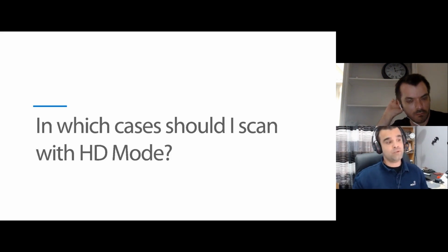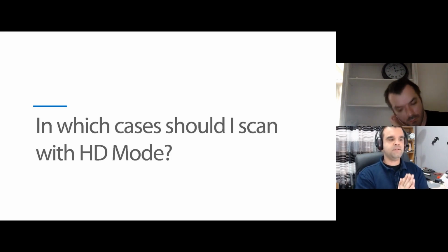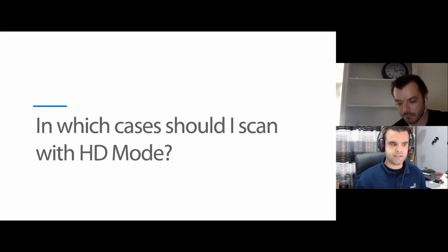In which cases should I scan with HD mode? Okay, I will specifically explain, but keep in mind that you can use it for everything. It doesn't matter at all. It doesn't cause you any problem. It's not a barrier. You can use it for all the cases if you want. But keep in mind two things.